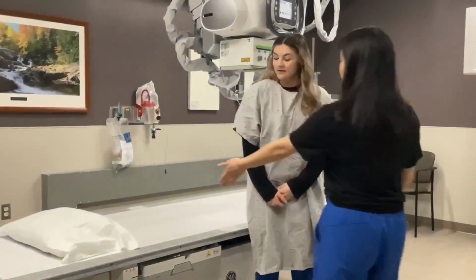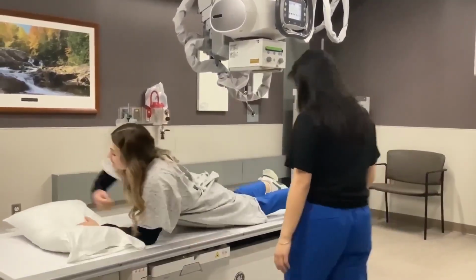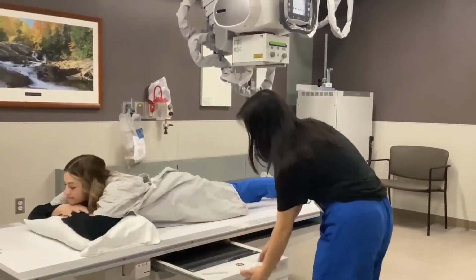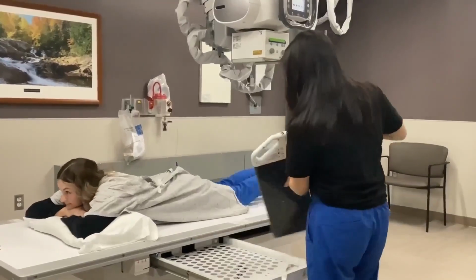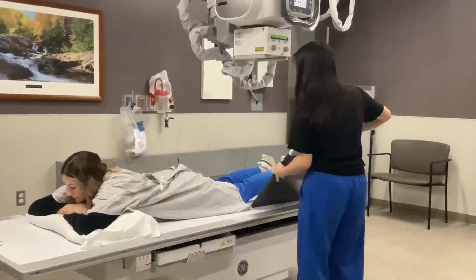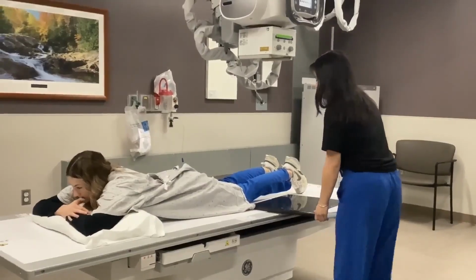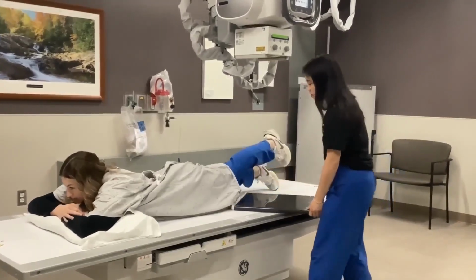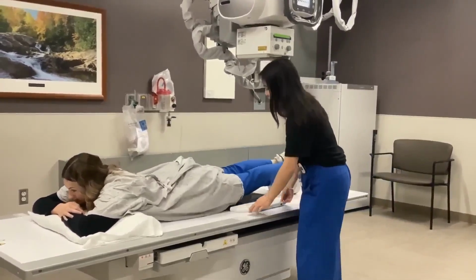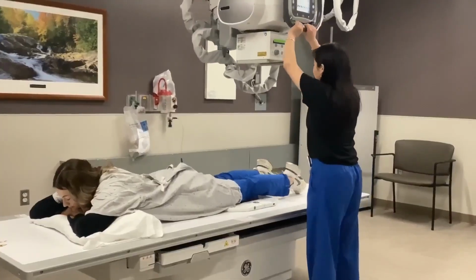Patient positioning for this exam is going to have the patient laying prone on the table with the affected leg extended out and relaxed. You'll then take the cassette out of the bucky, as no grid is used for this exam, and you'll place it underneath the affected knee. It's important to note that according to Bontrager, no gonadal shielding is used as it may obscure anatomy and does not significantly reduce the dose.